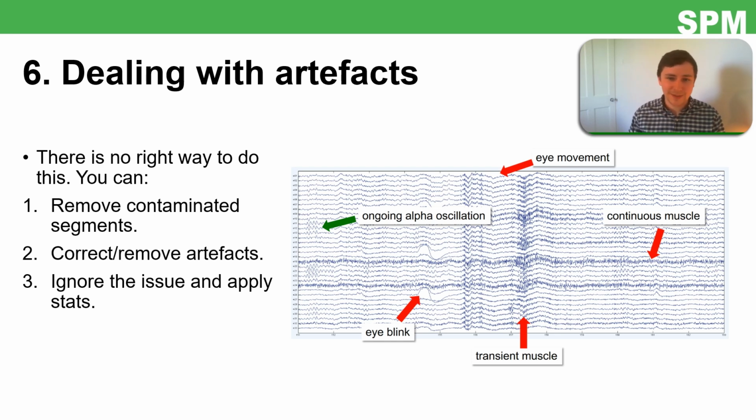But sometimes, as I mentioned earlier, artifacts can have their own design which gets around all of these things. Perhaps they overlap in time. Sometimes maybe more in one condition than another. Maybe sometimes you can't filter them out, like an eye blink which occurs at low frequencies, and maybe you're looking at theta. You can't apply a temporal filter there to remove the eye blink.